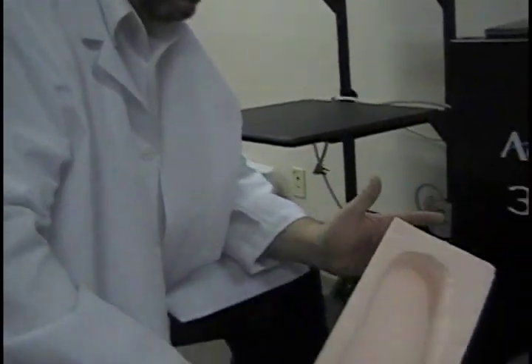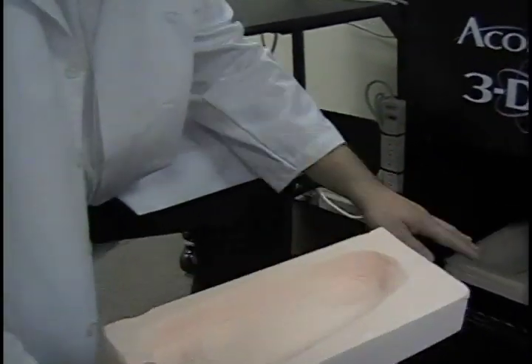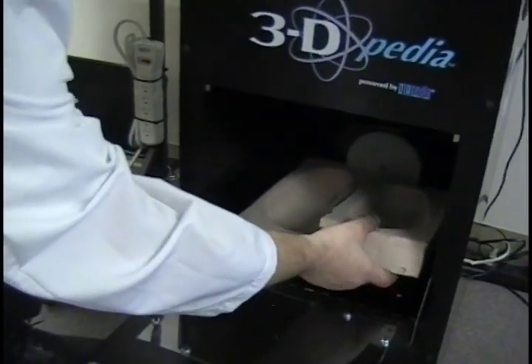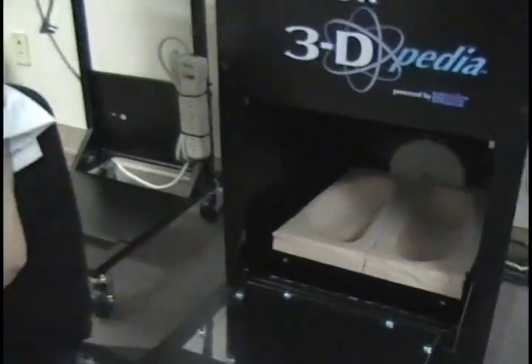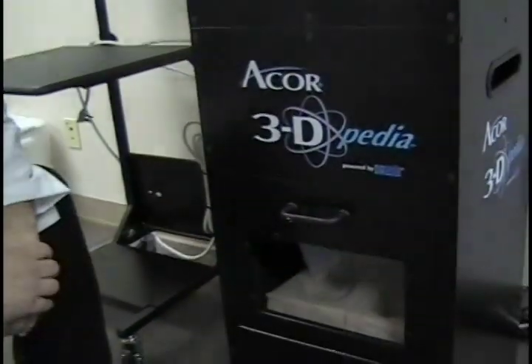Now you need to take and put the foam into the scanner. You want to do it heel first. It's pretty simple. You'll see there are tabs in here. Slide it all the way into the tray, into the back, and slightly push it in very gently. You'll feel the tabs grab a hold and it is ready to scan. All we need to do now is close the door.